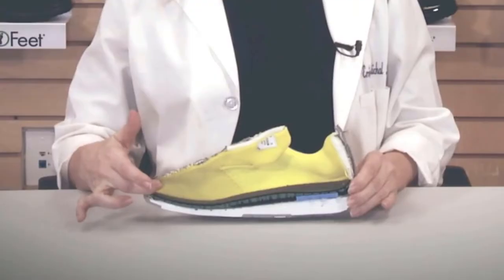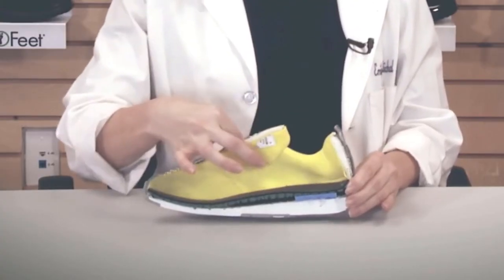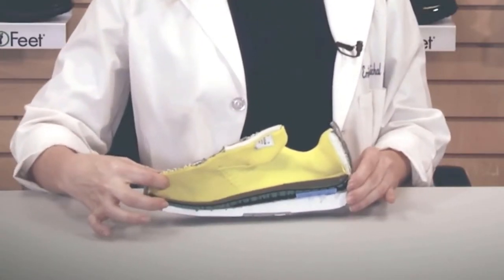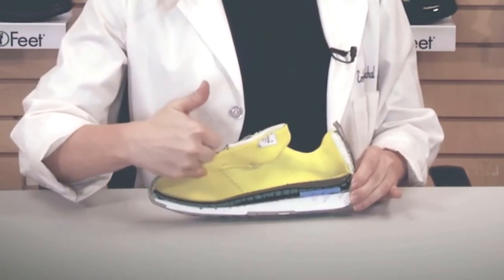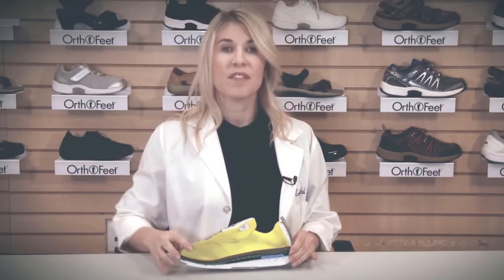All OrthoFeet shoes are designed with a soft, smooth interior. There's also a layer of cushioned foam across the back of the shoe, the upper, all the way to the front of the shoe. The front of the shoe has a seamless design, which avoids areas of excess pressure and friction. The soft, smooth interior is beneficial for those with sensitive feet and for those who may have diabetes with neuropathy, arthritis, and bunions.